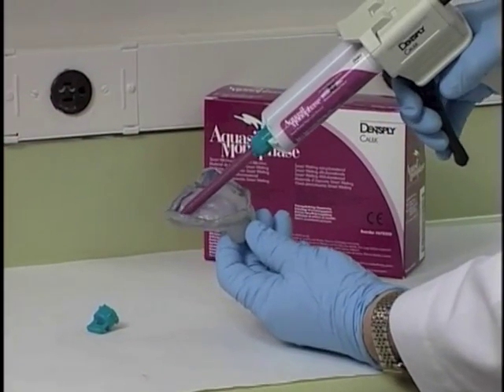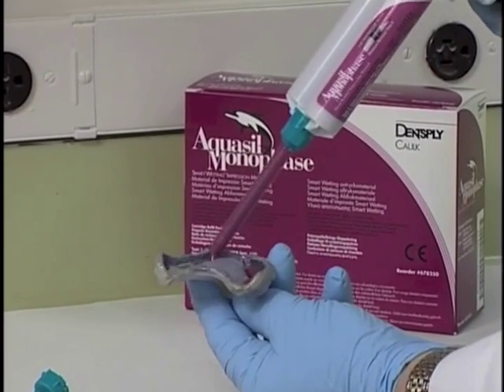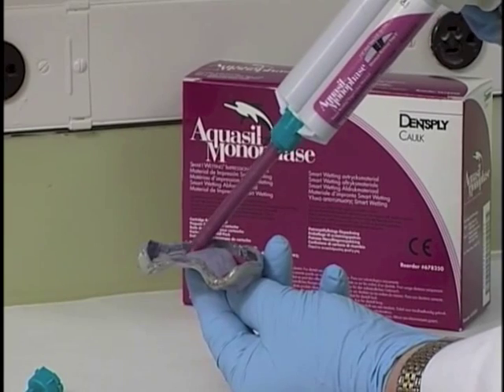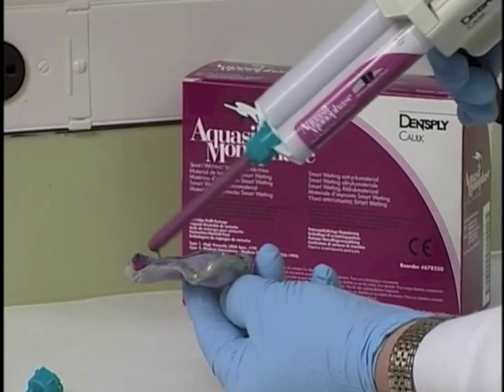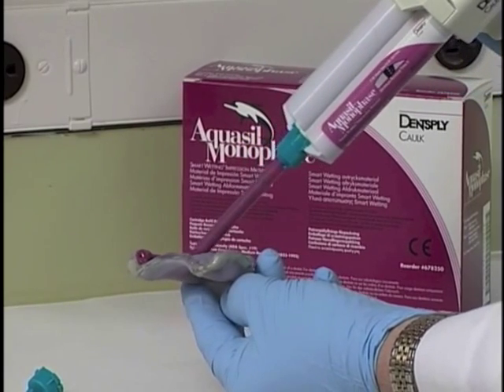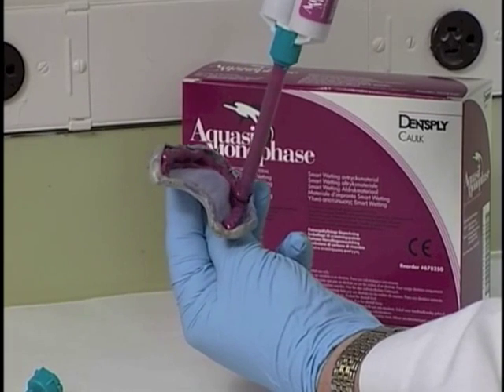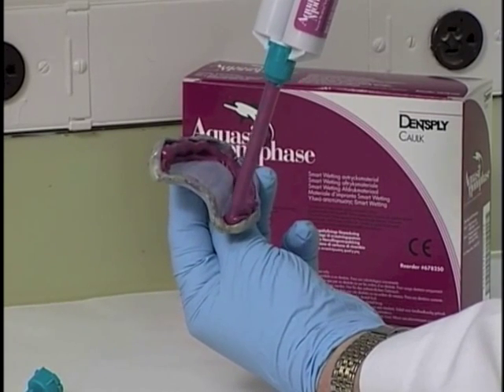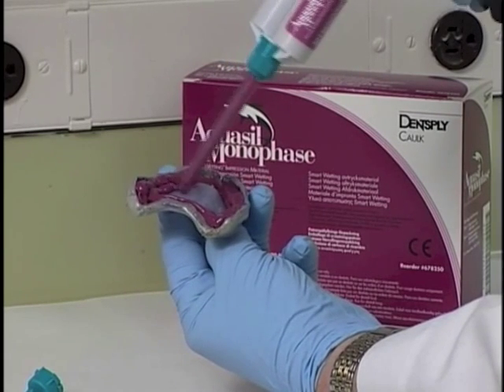with the material. I usually like to put 2 or 3 rows of the material onto the tray. And then place the material into the palate.